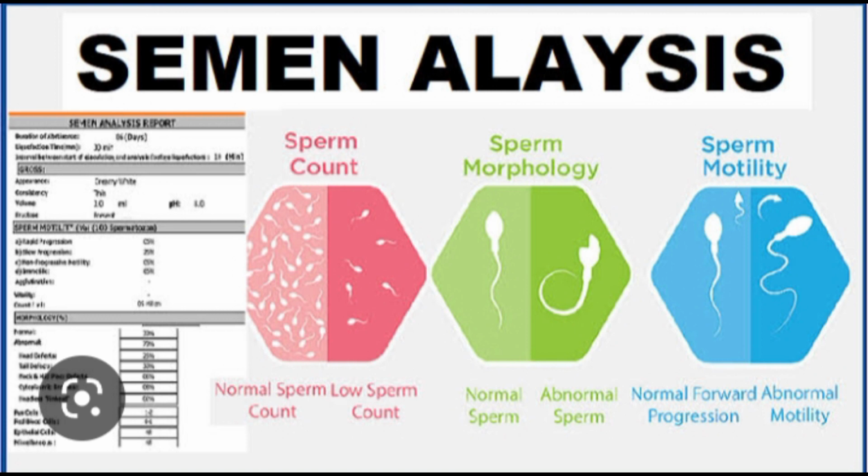Middle piece absent, swollen, bifurcated. Tail double, curled, rudimentary or absent. Semen containing up to 20% abnormal spermatozoa is still considered fertile. Final examination for cells other than spermatozoa, that is pus cells, RBC, epithelial cells, testicular cells, and crystals. Abundant crystals may be found in the smear, especially when the semen is left standing for some time.